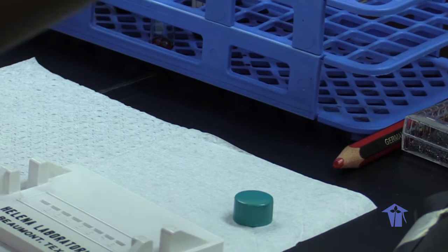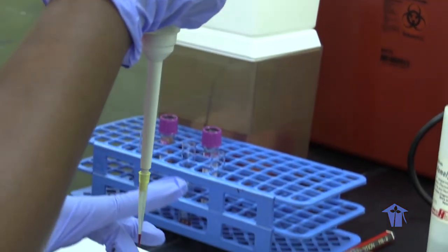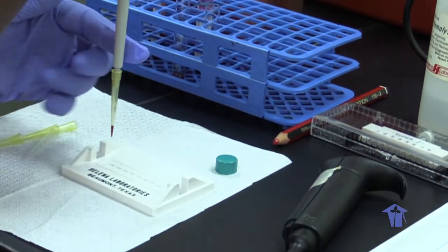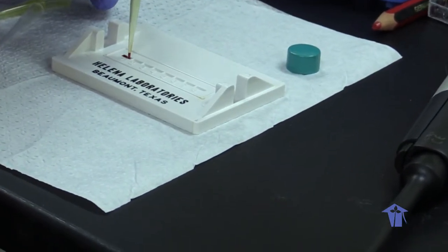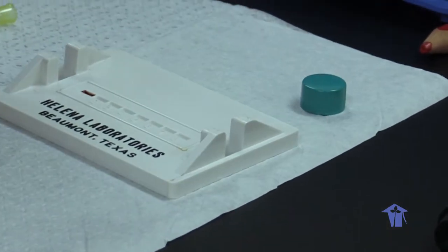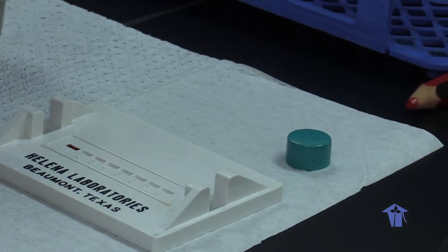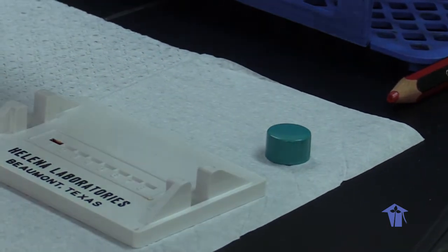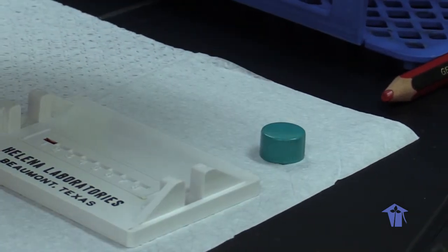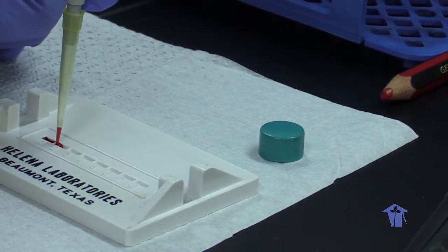So we're going to put 5 microliters of the sample into the wells. So we can pay close attention to the technique. We dispense the sample on one end of the well and just place our pipettes around like that. And do it again. So control in position 1. We're going to use a sample. Dispense.